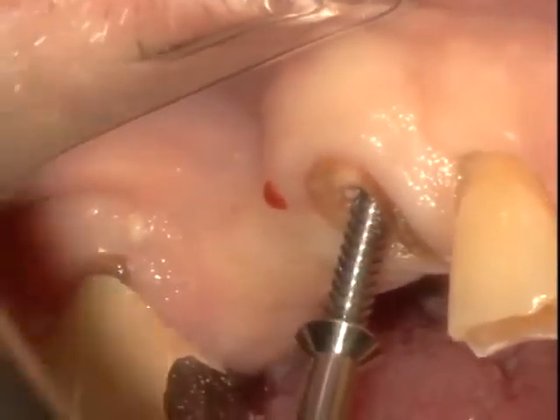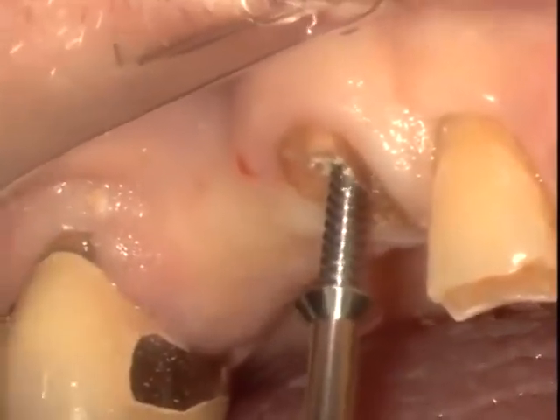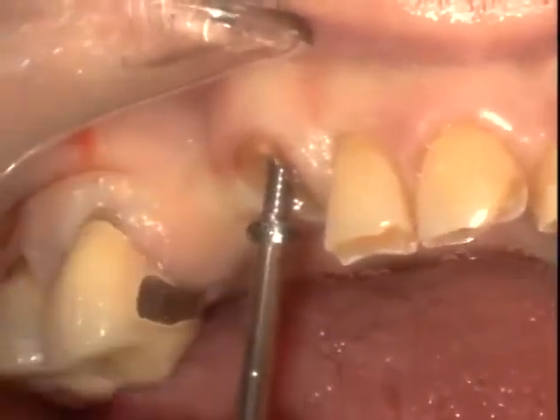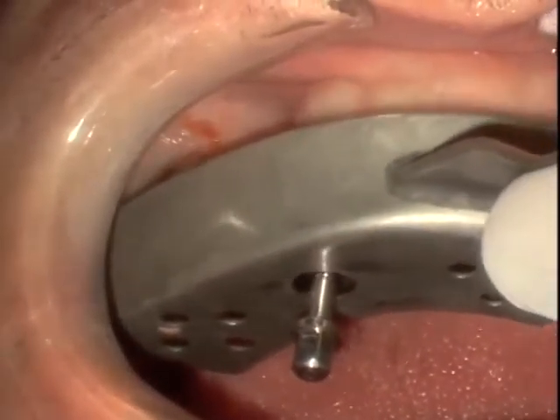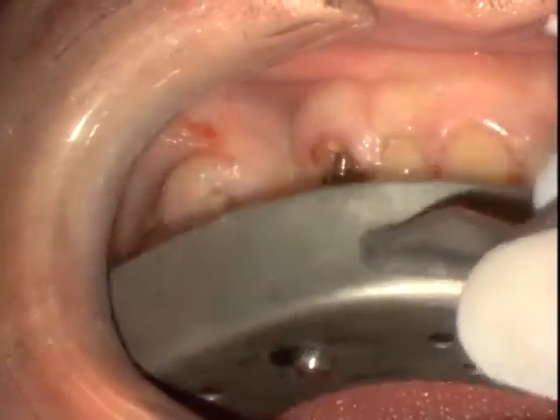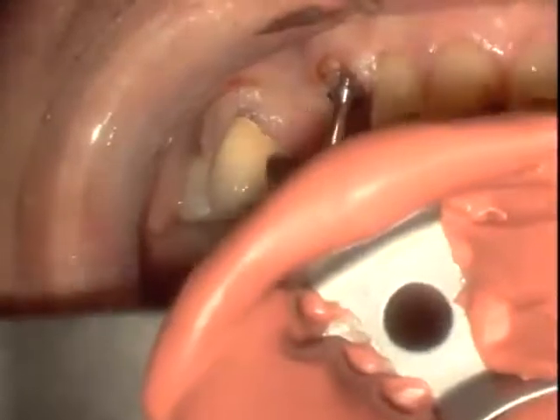This prepares the root for the reception of an extraction screw. Now, this extraction screw that you see being placed into the root is self-tapping and goes in very similar to how you would be tapping an implant. We slowly drive that screw into place, and then we place the impression tray. The impression tray needs to be placed in line with the horizontal line on the extraction screw to make sure that we have adequate space.